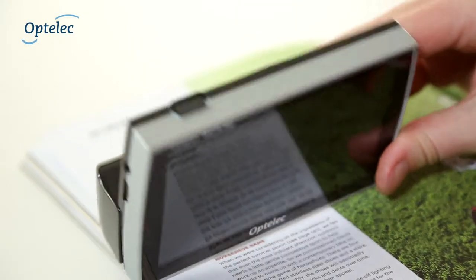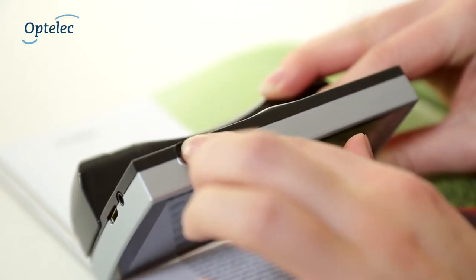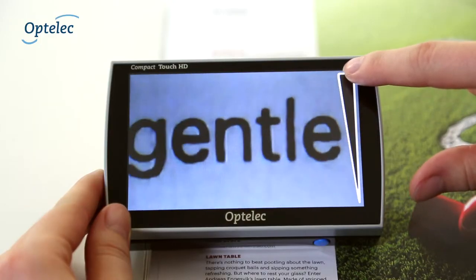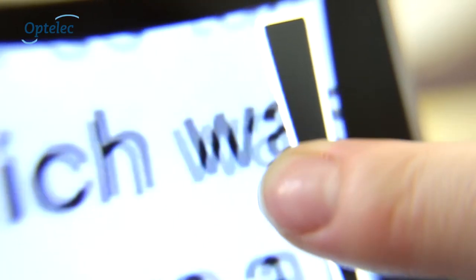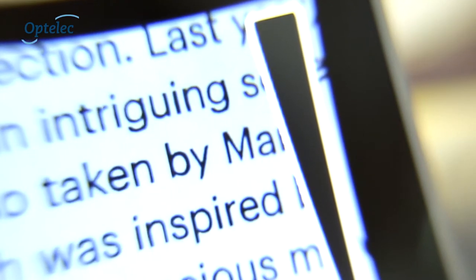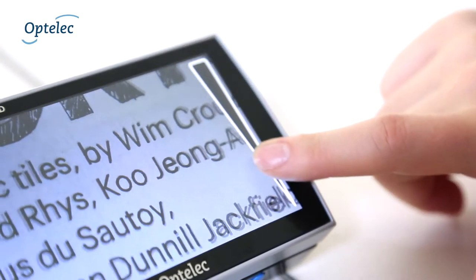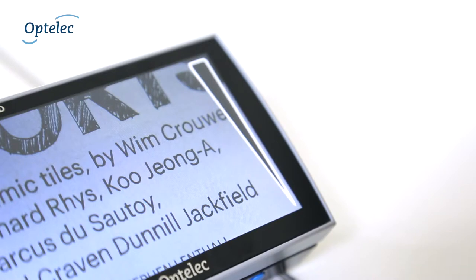To get started, press the on-off switch and turn the Compact Touch HD on. Adjust the magnification by sliding your finger over the zooming bar on the right or left side of the screen. To zoom in, slide your finger upwards. To zoom out, slide it downwards. You can zoom in 20 times the original size.